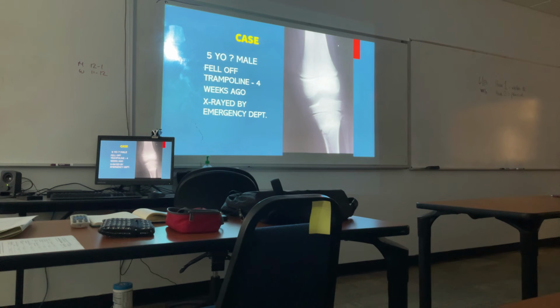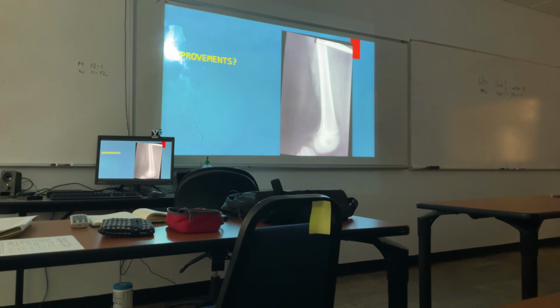I've shown you this before. How old is she? 5. You know the mechanism of injury, and it was x-rayed by the emergency department. For the last time, teaching point: don't assume that they do good work at the emergency department. There's an abnormality. Where's the abnormality?